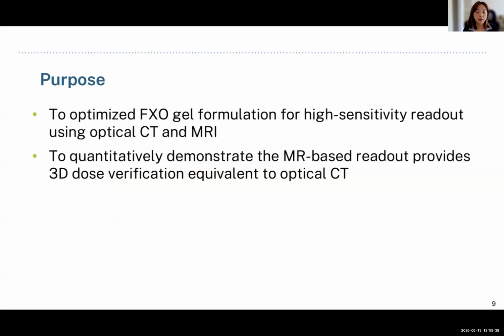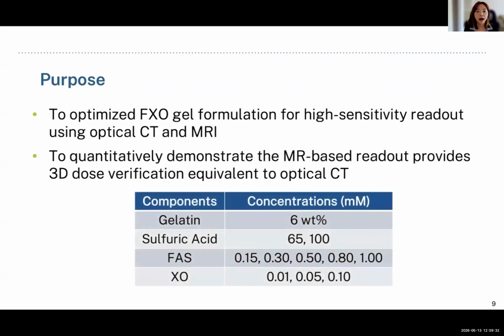So how did I go about optimizing this gel formulation? I began by systematically varying the concentration of the key ingredients within the FXO gel recipe, as shown in the table below. A combination of all these concentrations resulted in about 30 different formulations being investigated.